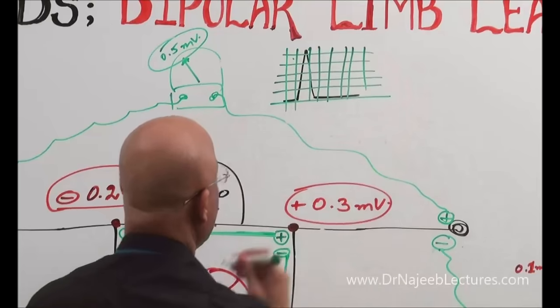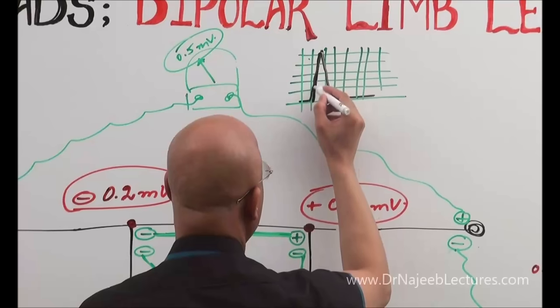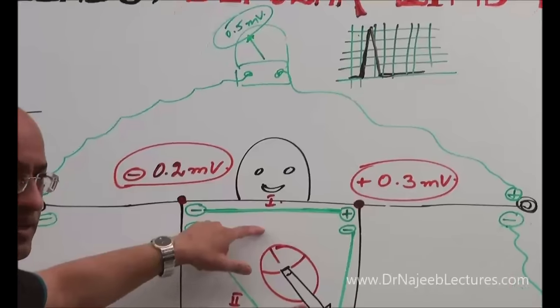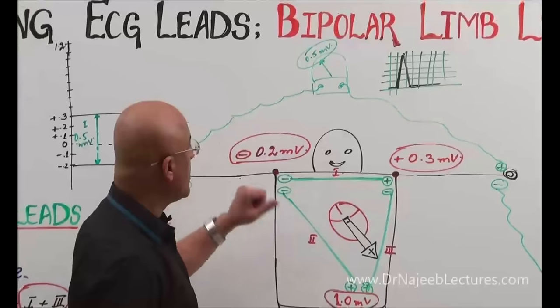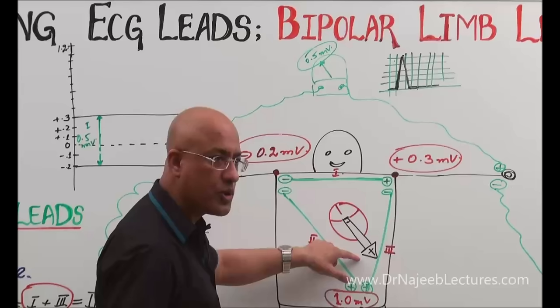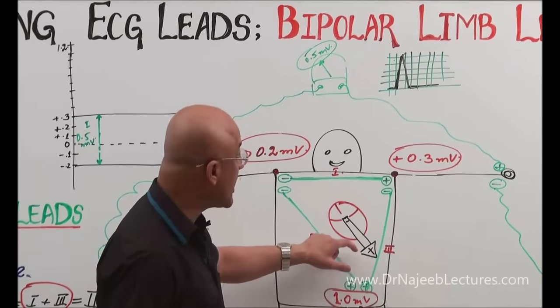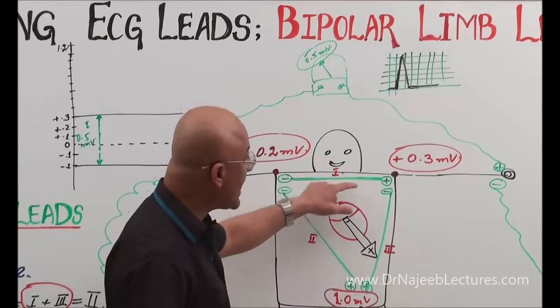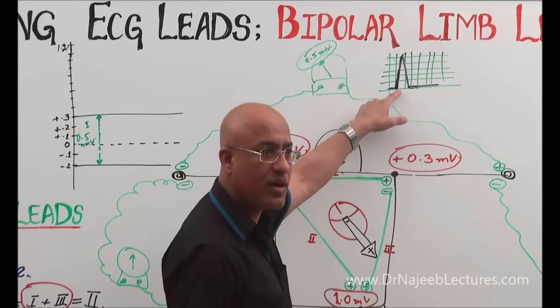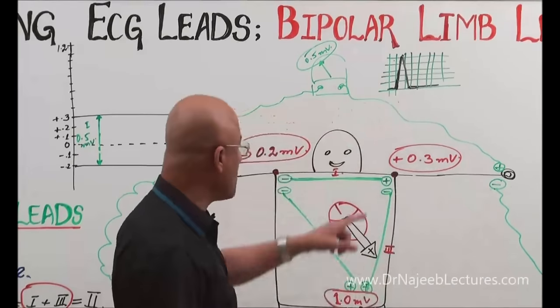Of course, if you want, I can draw vertical too, but in every diagram I will not draw the vertical. Okay? Now, what we really see is this QRS complex drawn by lead number 1. In this specific example, along the axis of lead number 1, when major ventricular depolarization is going on, the QRS electrical vector is graphically recorded with a net height of 5 small squares. Is that clear? Yes. No problem. Now we come over to lead number 3.